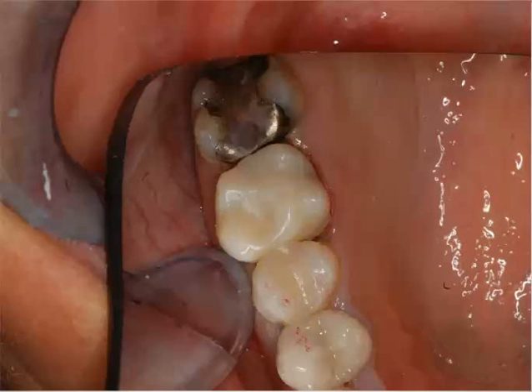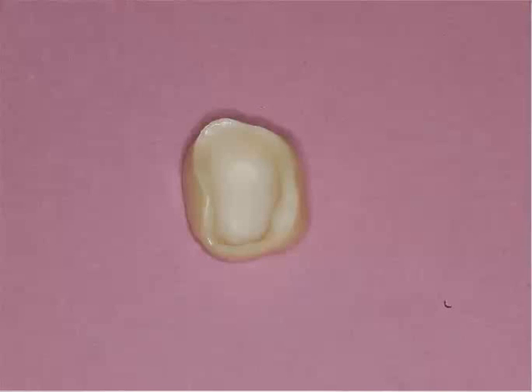You have the proper occlusal morphology, the proper occlusal contact, both interproximal and with the opposing dentition, which matches the original contours of the prepared tooth. So this really is a quick way of stabilizing the case because of the density of the material, because of the fact that it is wear resistant and polishes up well. The patient will maintain good hygiene. You'll have a good tissue reaction over that period of time, and it really allows less seating time when it comes to the final impression.